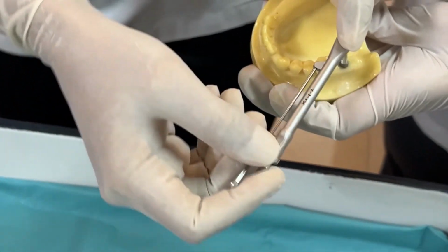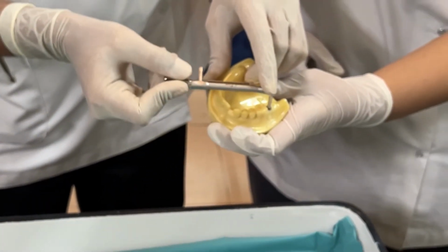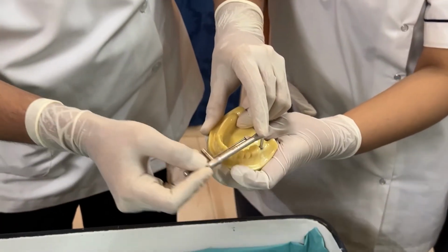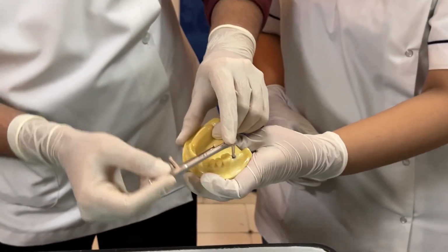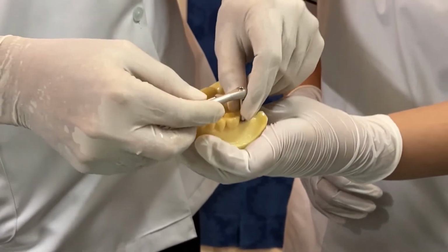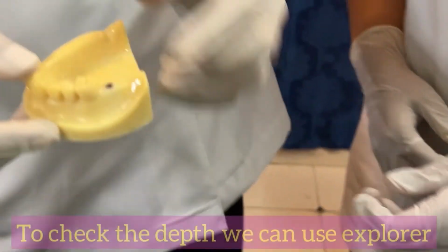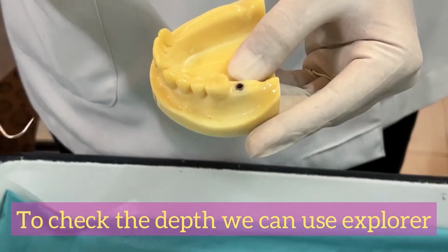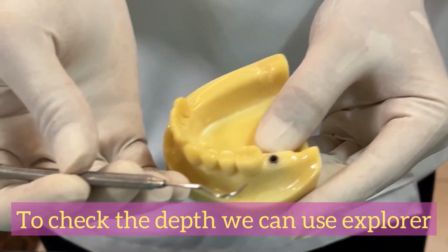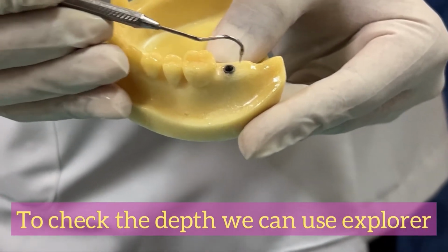Okay, there is no rush for it because ultimately some amount of bone expansion is desirable at the time of implant placement. That is good for the longevity of the implant. So now what has been done is, let's say I placed it initially. Now I need to check whether I have gone till the exact length or not, whether the depth has been achieved or not. So that can be easily checked, whether my implant placement is correct or not, with an explorer. So what we do is we move it on the adjacent bone and we try to move it like this.